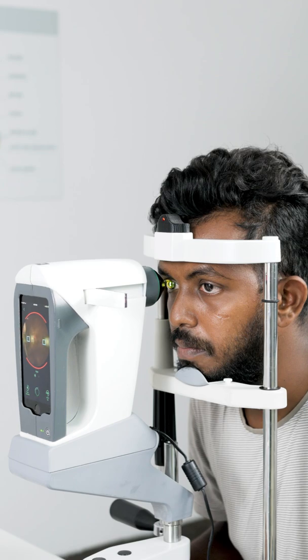This video will be split into three parts. First we'll see what's in the box. Then we'll show you how to assemble the device. And finally we'll show you how to capture a fundus image. We'll also have a look at some of the extra features of the Vistaro app.